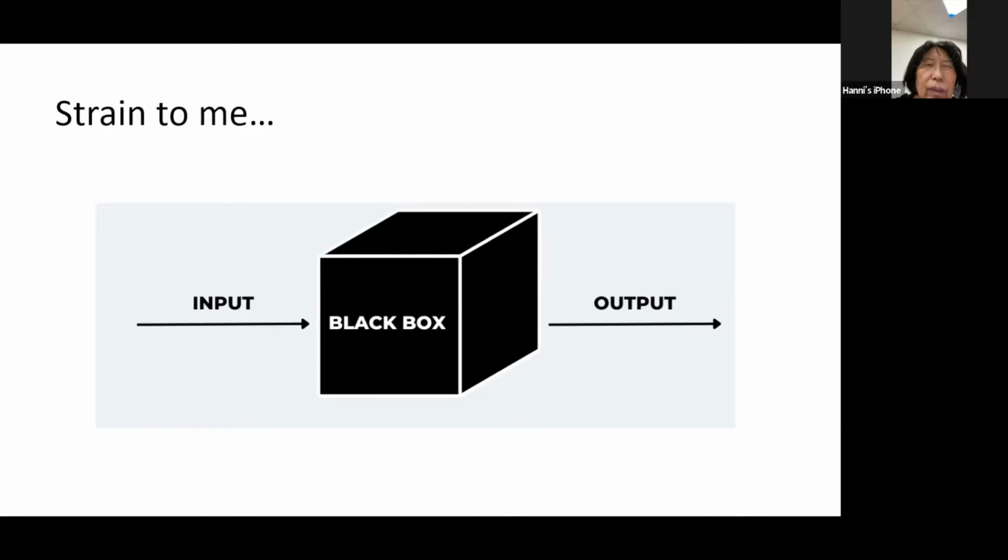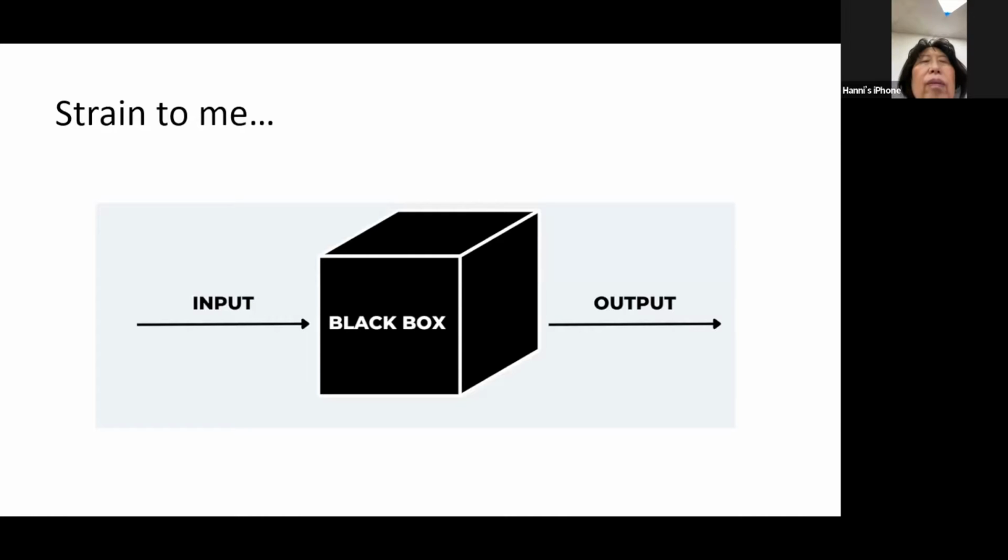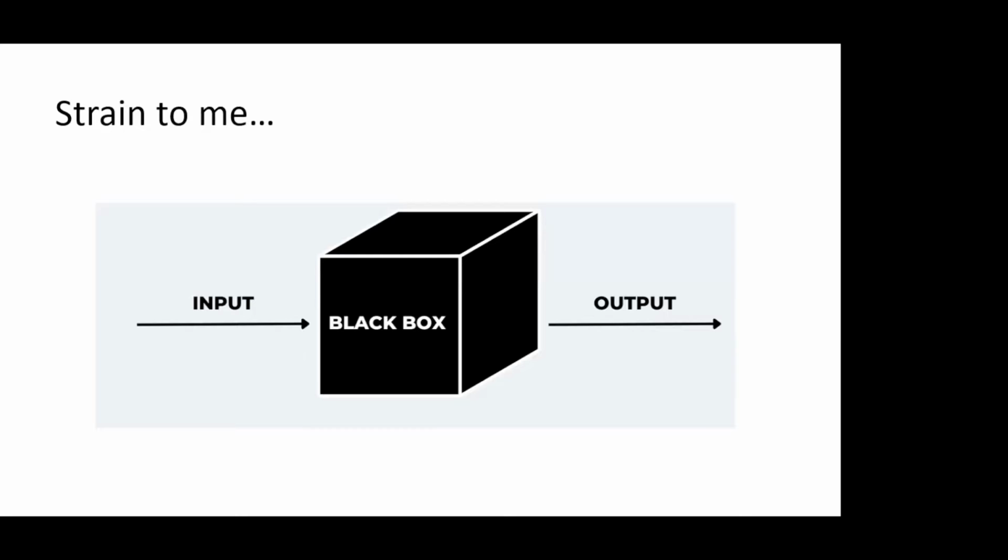So the inspiration was because strain felt like a bit of a black box. I could see the inputs. We see very colorful images that the sonographers have taken where there's tissue tracking, but then I would get a number of average GLS, and at the end of the day, that's really all I reported. I would just put the GLS number on the report, and that would essentially be it.